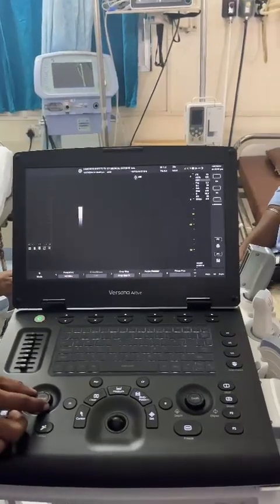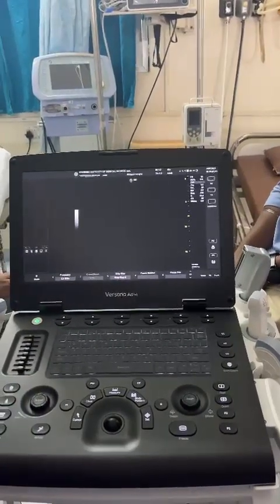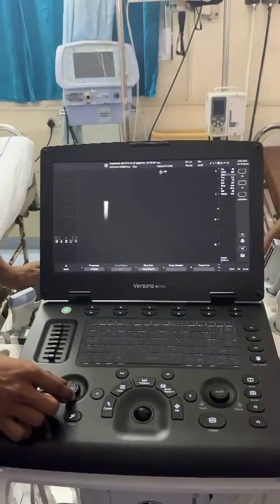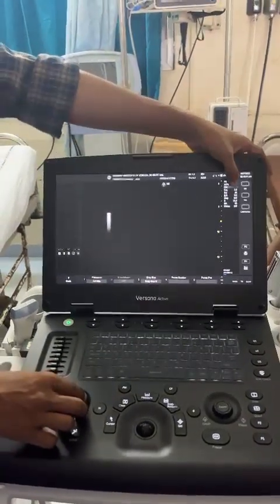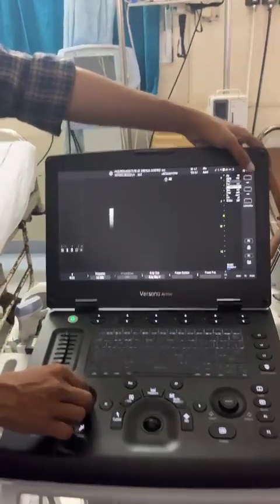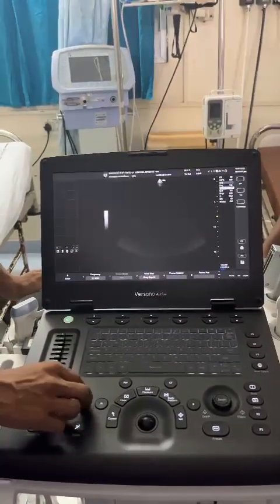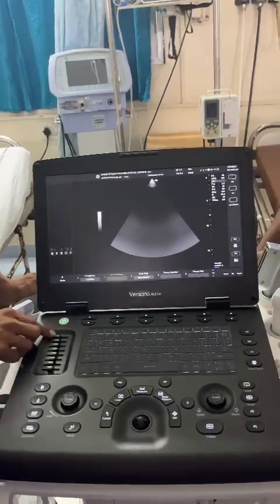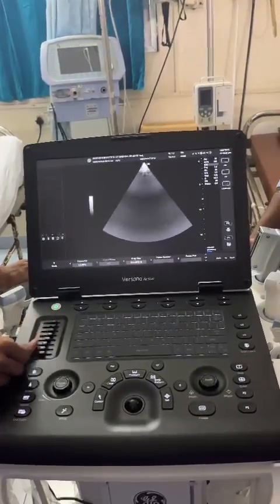This is our gain — overall color, PW, and D mode. Overall gain is for this one. Here you'll observe the gain increase or decrease. This is our TGC screen, and we can increase it layer by layer.